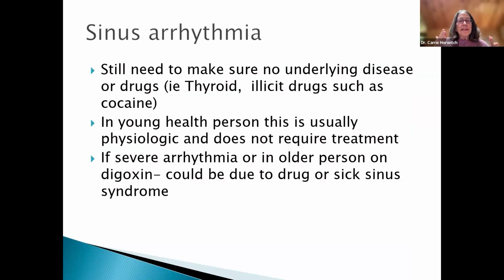And so sinus arrhythmia is still a sinus rhythm. P followed by QRS, QRS preceded by P, but it was irregular, right? So with the P waves there was some spacing, some were closer together. Sometimes this could be physiologically normal in certain people. If you listen to the heart, you might actually hear that it sounds irregular. You may need to make sure what medications they are on, or drugs, substance use, or thyroid condition that could cause that.